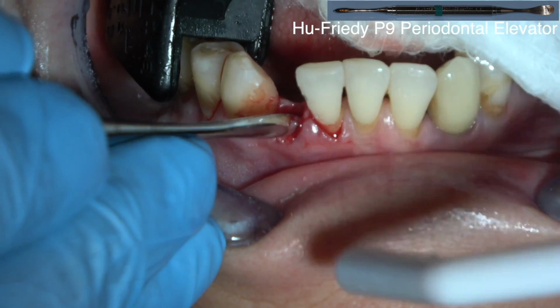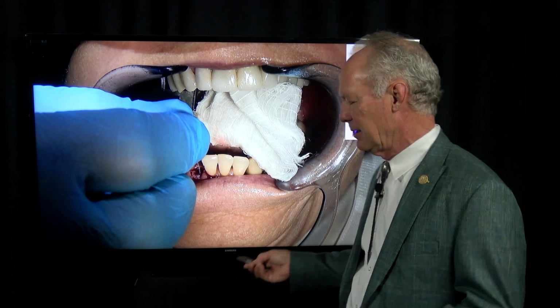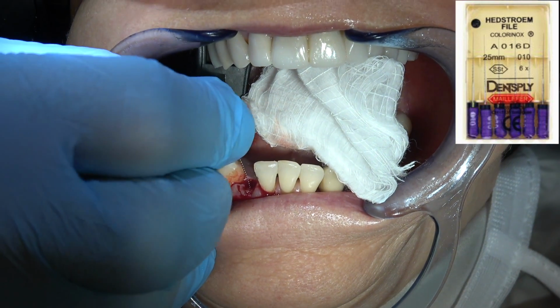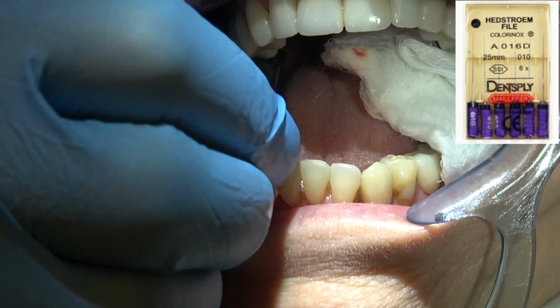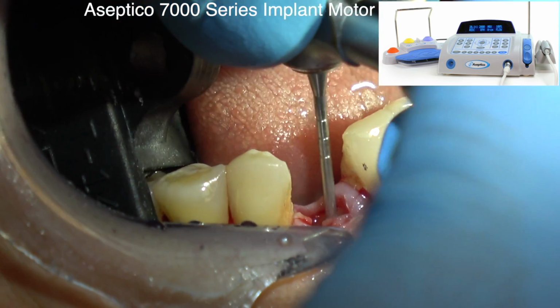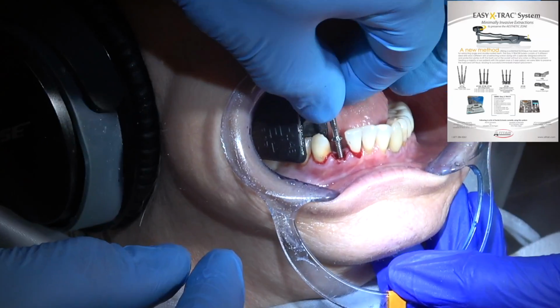Now, I had my videographer video the whole thing because extracting a tooth can be a time-consuming thing. If you've got a high-volume practice, probably the most unpredictable thing you'll do is extract an ankylosed, endodontically treated, or internally resorbed tooth. So I'm going to try to extract the rest of the tooth with the Easy Extract. So I start out with a Hedstrom file, and I'm just opening the canal so I can drill the Easy Extract drills into the canal of the tooth.